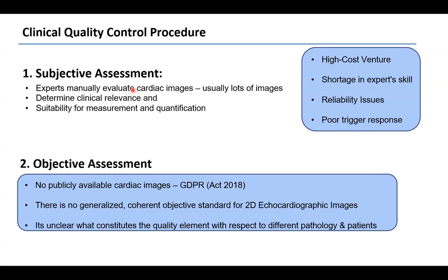Reliability issues and poor trigger response also come as a result of subjective assessment. Now, the way around this is to go with objective assessment. However, there are 3 main issues that need to be resolved in order to implement objective assessment for cardiac frames.